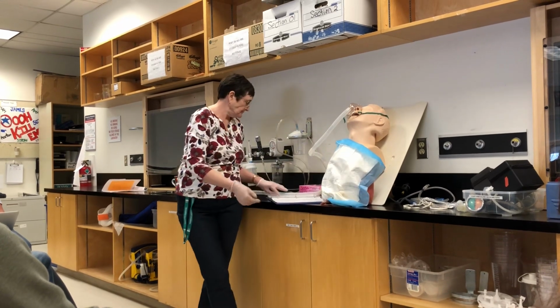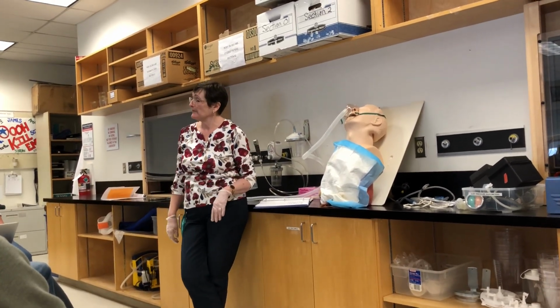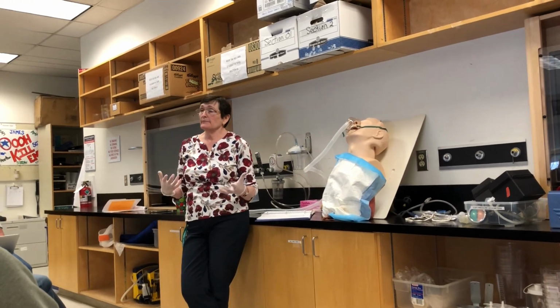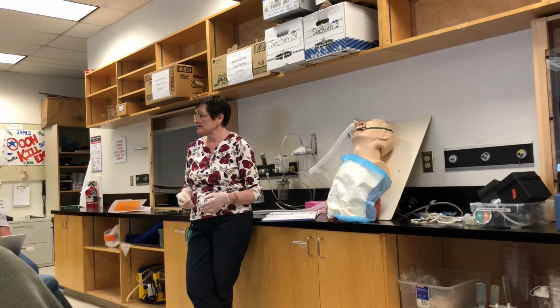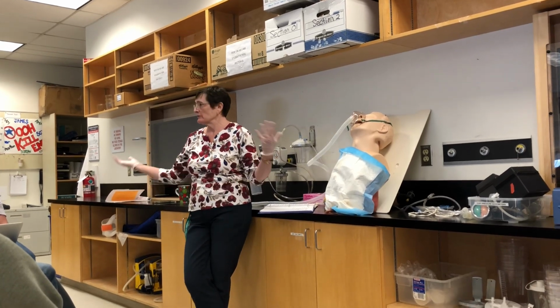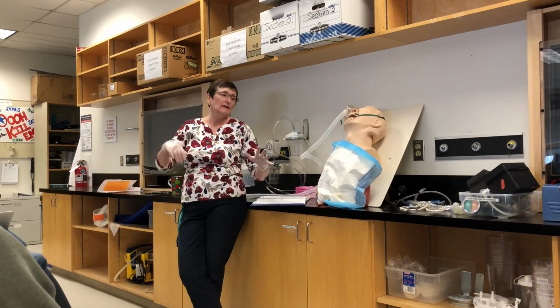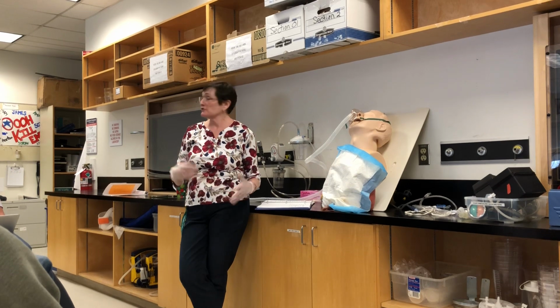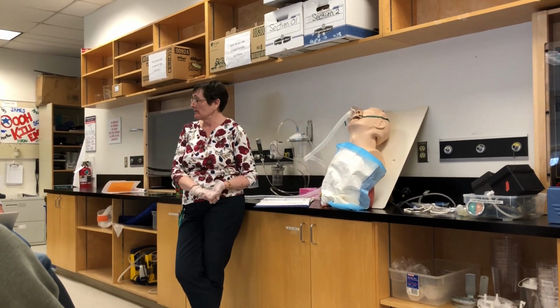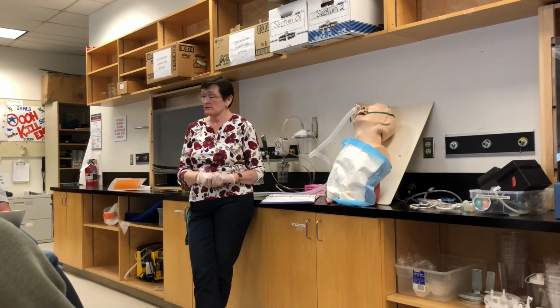Is that all a one-person job, Heather? Yeah, usually. When we did extubations in the ICU, it'd just be the one RT, or student. We'd drag a student in and have them do it. It's always fun to do it that way. But the nurse is always there. And if there's any medications that need to be given, she'll be giving them, except for the nebulized ones, and we would give those.